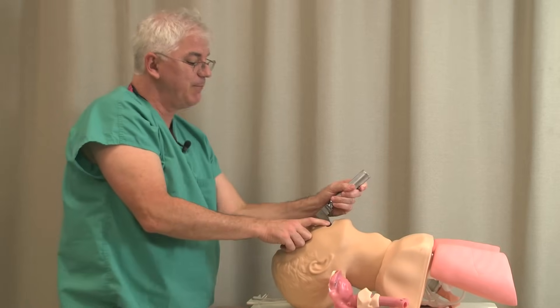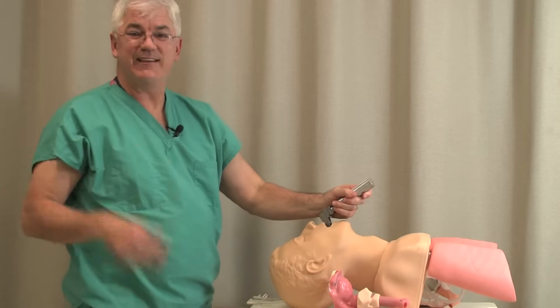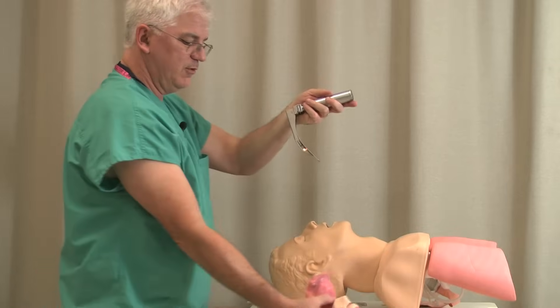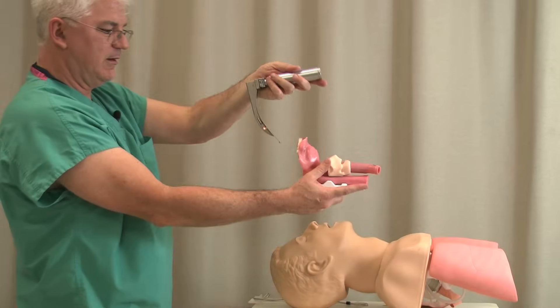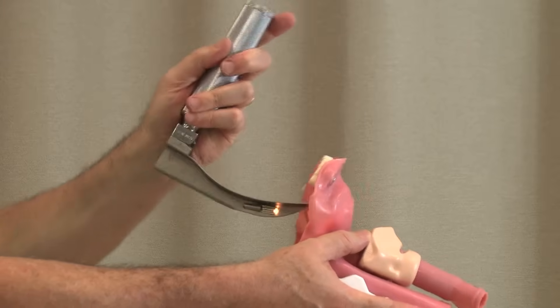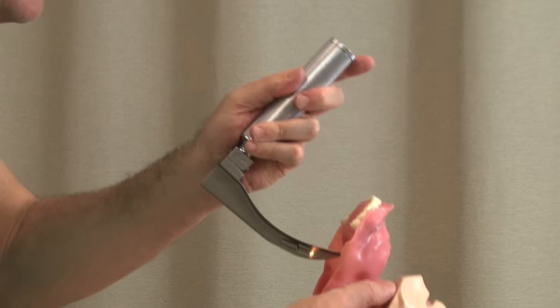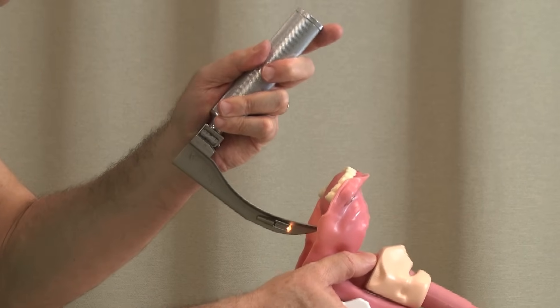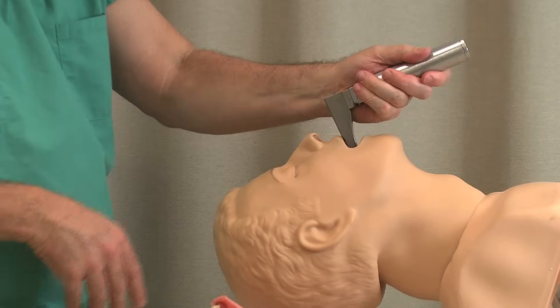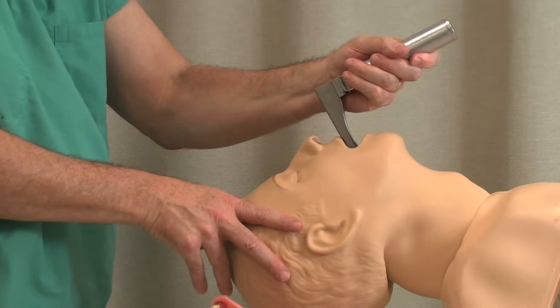If I crank back, you hear that clicking sound — I'm clicking against the teeth. Plus if I crank back, I'm actually cutting off my view. So if I have a pretty good view and I crank back, I've not only damaged the teeth, I've cut off my own view. Once you get the view, you lift — you might have to come back a little. The epiglottis pops down and then you lift again.